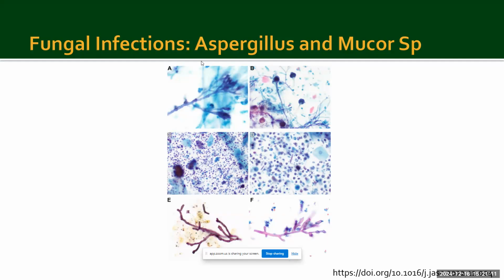Or if the cytotech alerted you, it's a good habit to prioritize these cases, look at it by yourself, form an impression, and go sit with the attending to try to evaluate if you can come up with a mutual understanding of whether you want to call it aspergillus or leave it as vague, or want to confirm mucor if the patient doesn't have any serological studies sent.